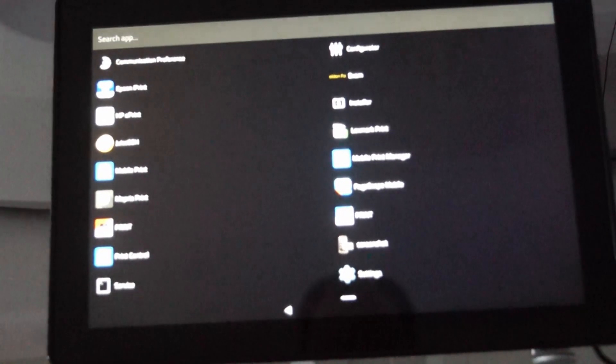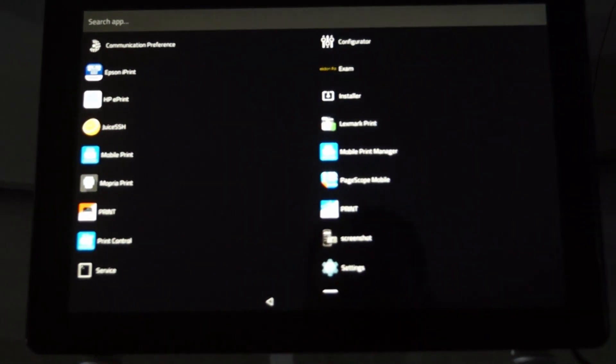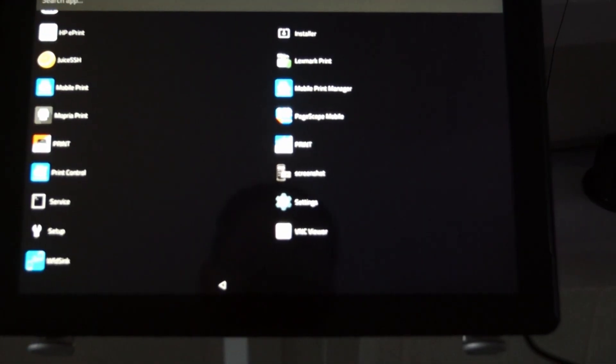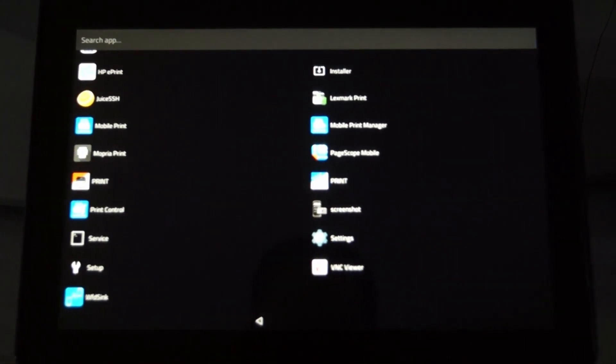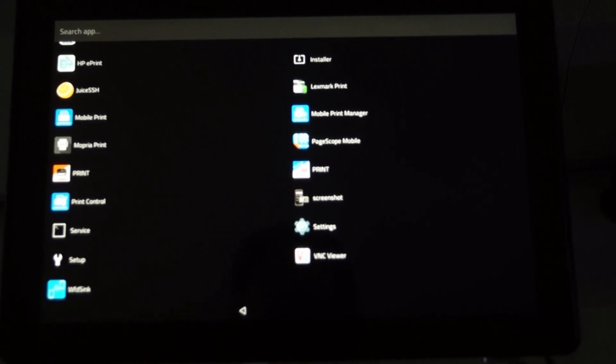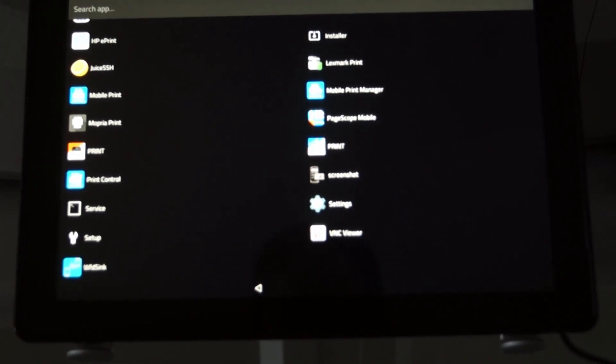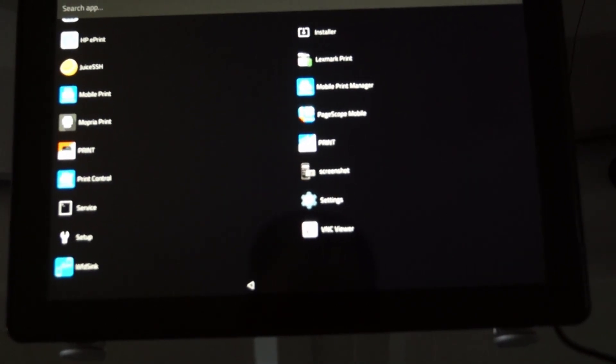That covers the viewer. Now for settings: there is a pre-installed Epson print driver. You can set up printing via Bluetooth to a mobile printer or via cable. All things can be sent to a printer, to USB, or to a predefined folder. You can change landscape orientation and add predefined information to report sections.